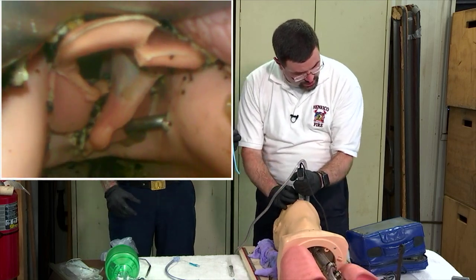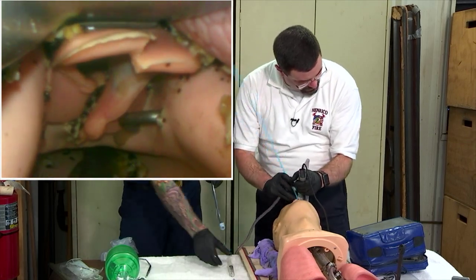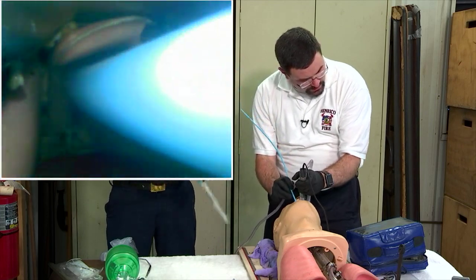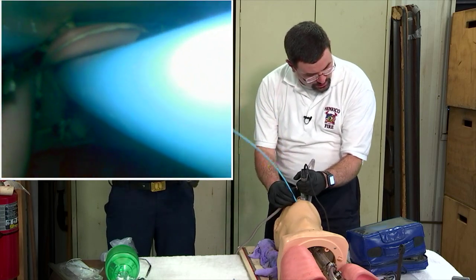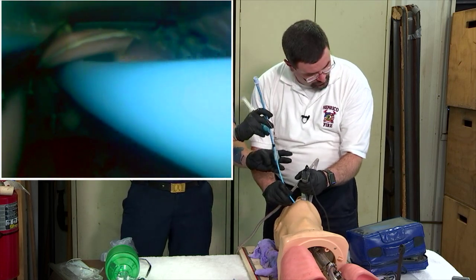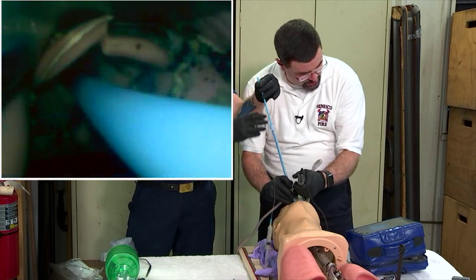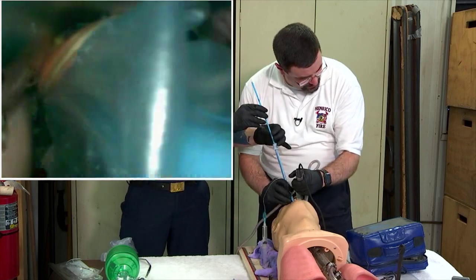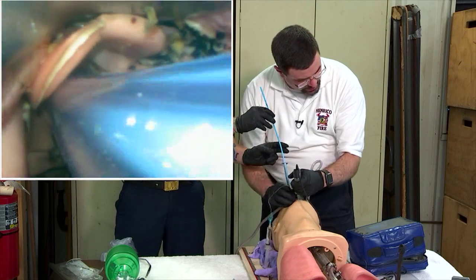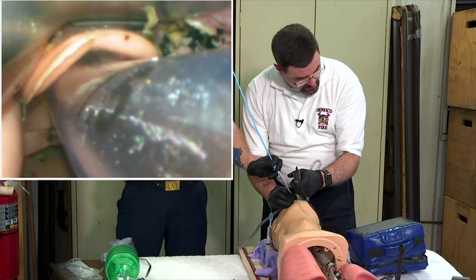Switch sides there. My bougie's going down through the cords. Peter's going to load my tube onto my bougie. Tube's coming. Okay. I have the tube. You have the bougie. I have the bougie. Okay, we're going to advance the tube off the bougie. It's a little stuck. I'm doing my counterclockwise turn. And you may pull the bougie, please, and inflate my cuff.